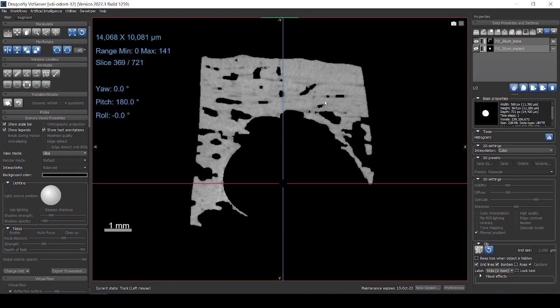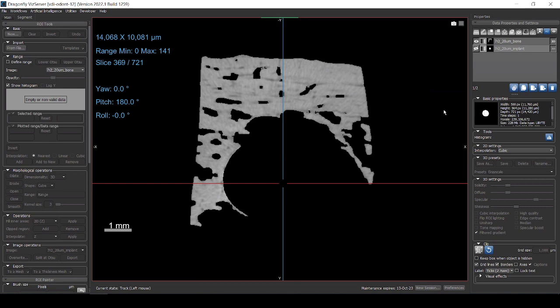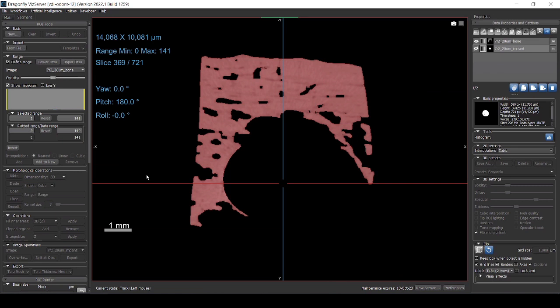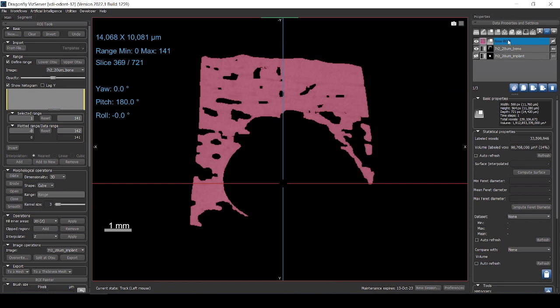So let's start by having this view here. I'm going to look at the XY view, and if I go to the segment, I can define range and click upper Otsu. Since my image is basically two phases, it's easy to segment by Otsu here. So I have just the background as black and the bone as the phase. So I'm going to add to new and I'm going to rename it to bone.